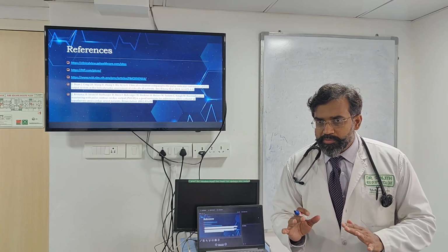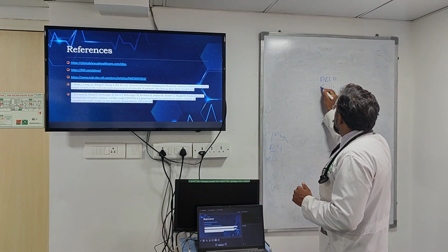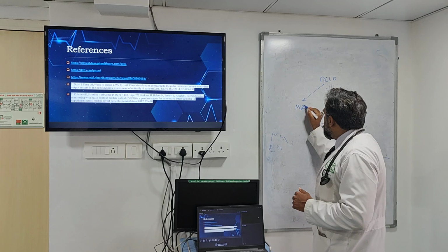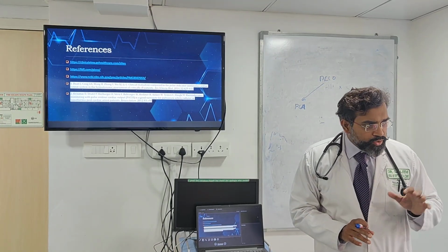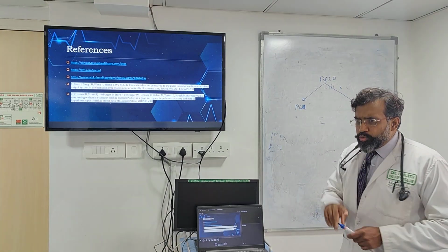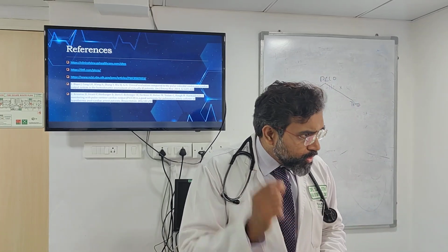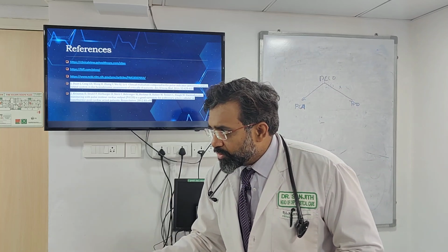It is using pulse contour analysis, or PCA technology, and it is also using transpulmonary thermodilution. So there are two things they are using in Picco.